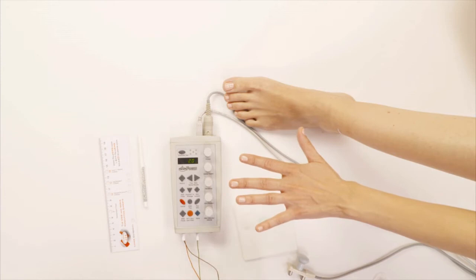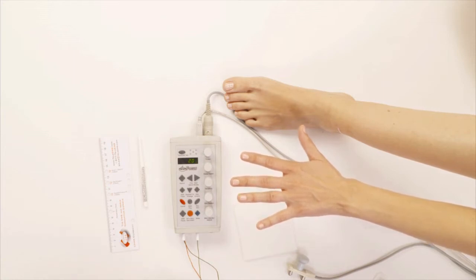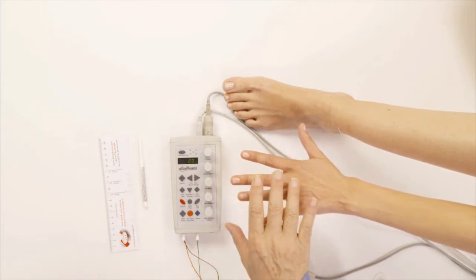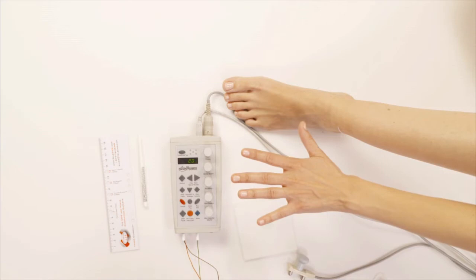In fact, you can't even have the covers when you're lying down in bed cover your feet because it will trigger a burning sensation. Unfortunately, these are not easily detectable by routine nerve conduction studies, so we do the galvanic skin response to find out if the condition is due to a small fiber neuropathy.